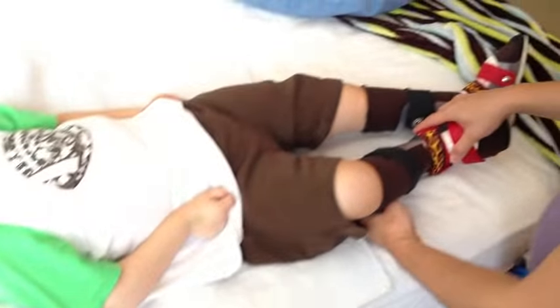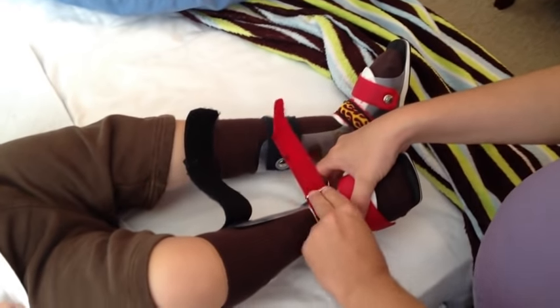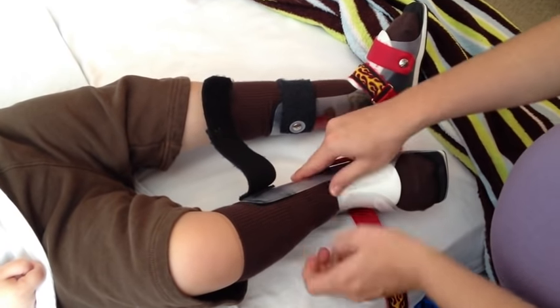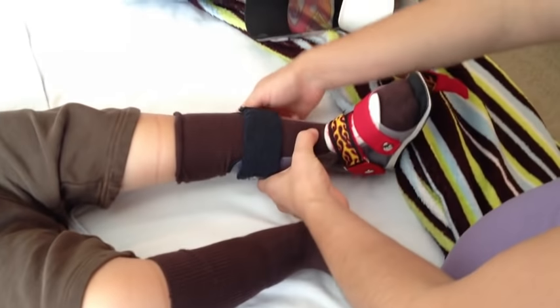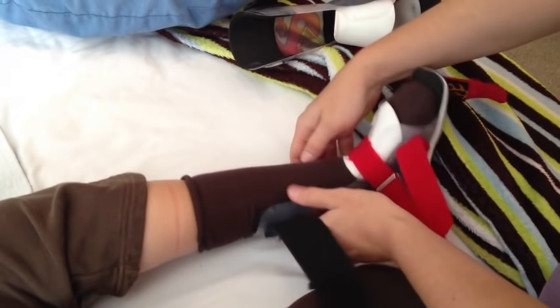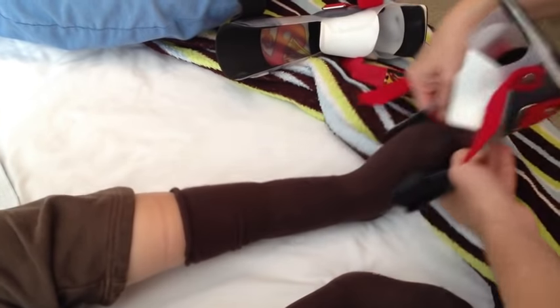First we're going to start with his braces and show how to take these off. You're going to undo the velcro, then grab the plastic with both hands right above the ankle, pull it apart and slide his foot out. Then repeat with the second shoe — undo the velcro, pull apart at the ankle, open it up and slide it right off.